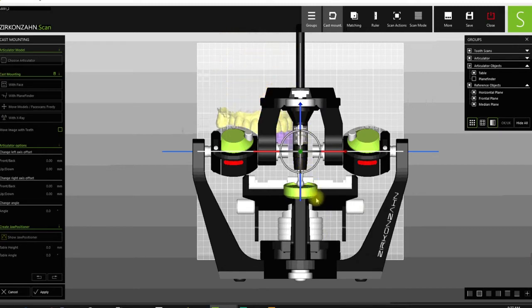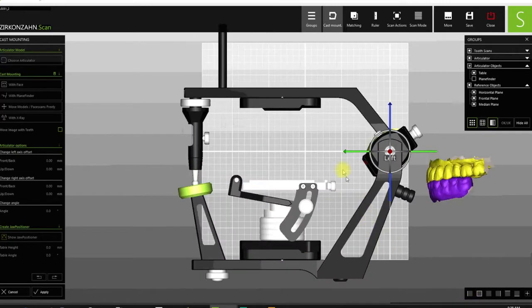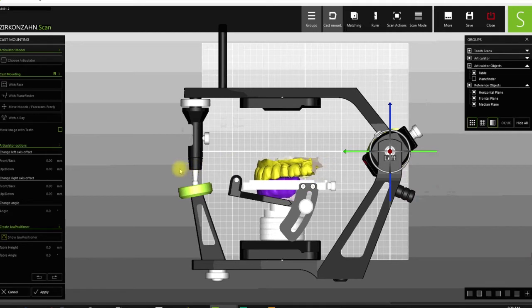So come straight down until your teeth are even with the top of that little table. And then this one you want to move over. Look where I grabbed here to do it, and move over to the midline. Okay, and then go down and do 1 turn here, and you're going to scoot the teeth forward to the table and go right in the middle there, and that looks damn good.